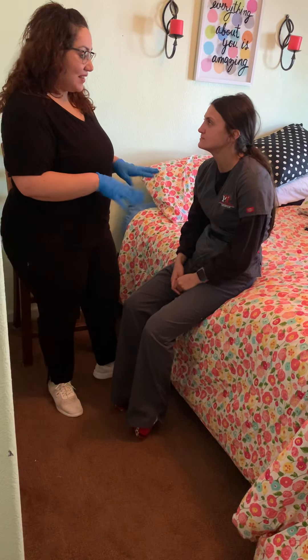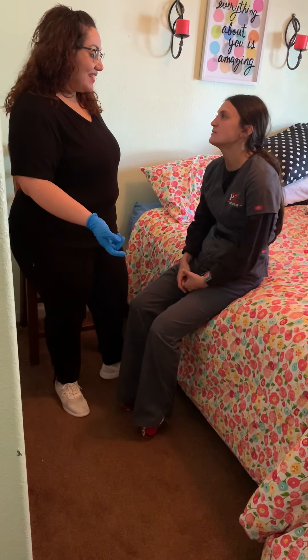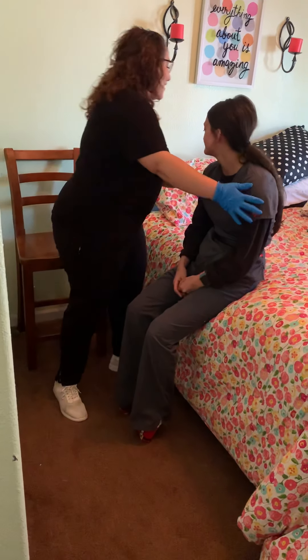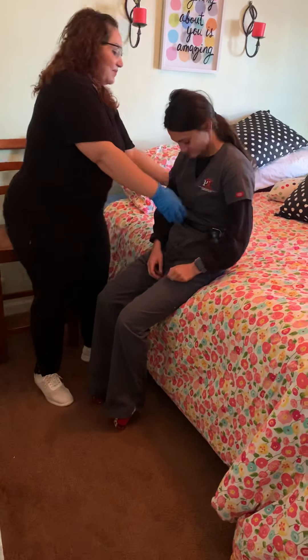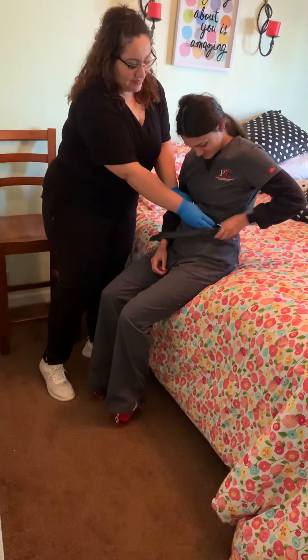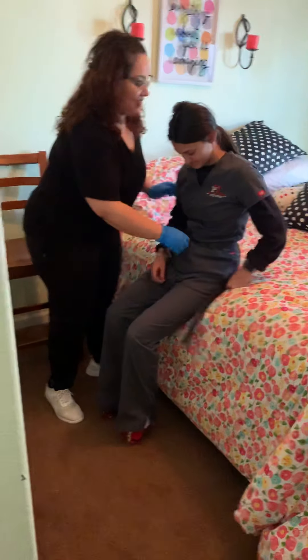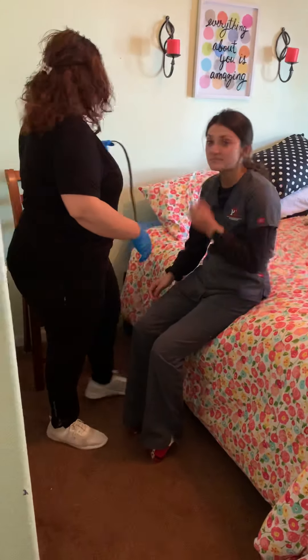So then we'll walk back. Here you go — we're at the end of the bed again. We're going to go ahead and sit her down. One, two, three. I forgot to mention: when they're falling, you do have to hold on — not to their body, but to the gait belt and to the armpit area right here — to support them, but do not pull in, to prevent your back from hurting.